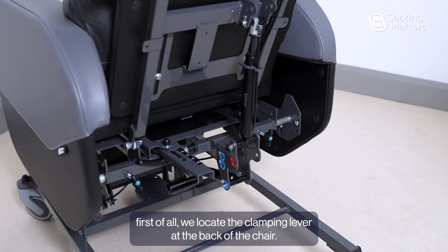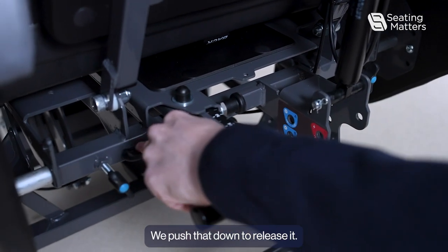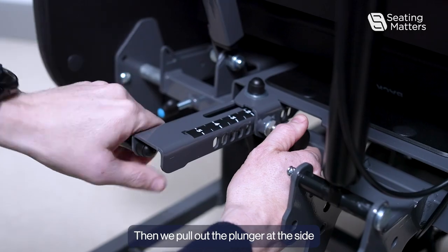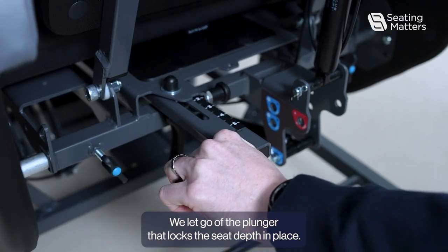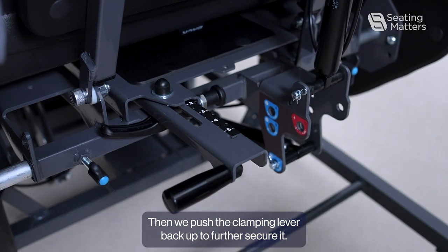To adjust the seat depth, first locate the clamping lever at the back of the chair. Push that down to release it, then pull out the plunger at the side. That allows us to move the seat depth in and out as required. Let go of the plunger to lock the seat depth in place, then push the clamping lever back up to further secure it.